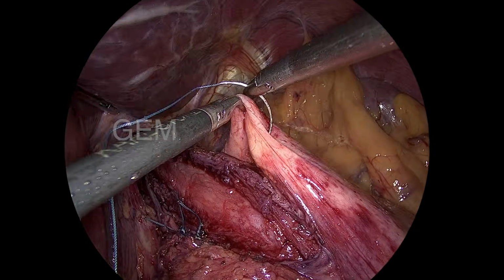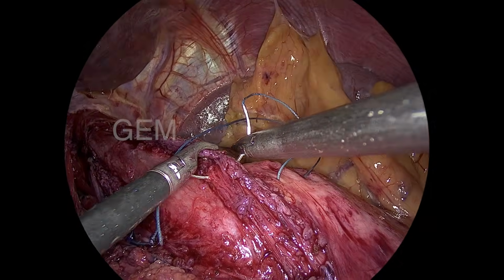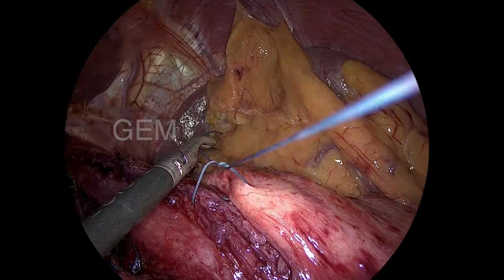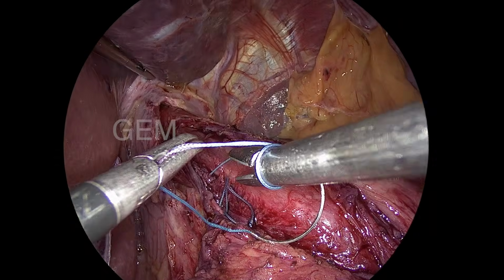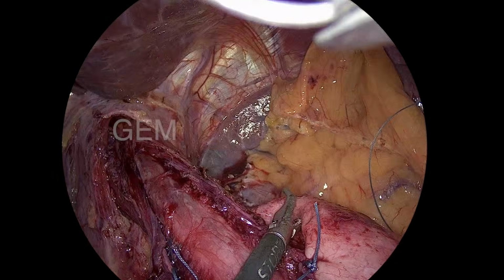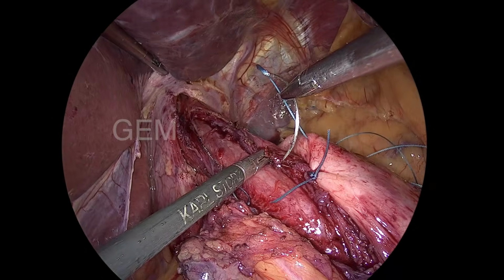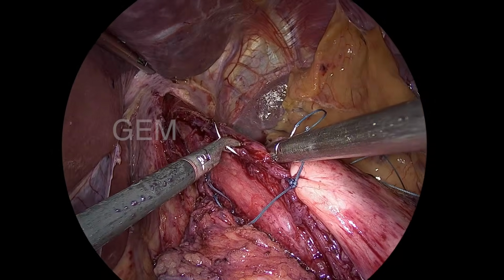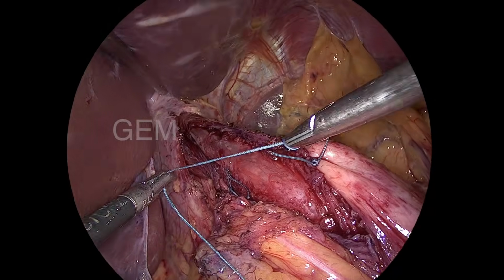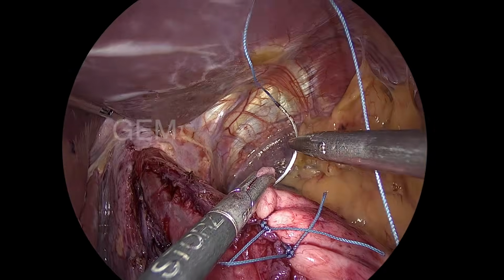Again, this is the anterior wall of the fundus to the divided edge of the muscle on the left side. I am not taking the mucosa. Now, you can appreciate the 180 degree anterior, the anterior mucosa is completely exposed. This is one of the surgeries that all gastro surgeons, general surgeons and laparoscopic surgeons can do. Here, both things are corrected: the dysphagia is corrected by myotomy, and the reflux, which is common after myotomy, is also corrected with the fundoplication.